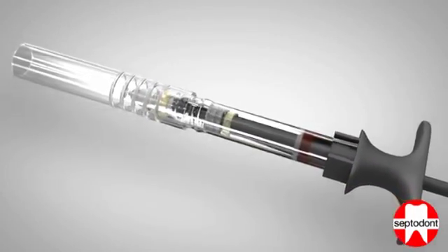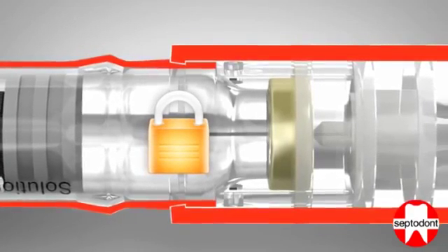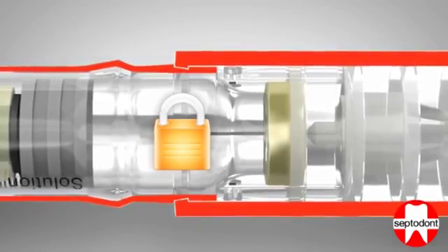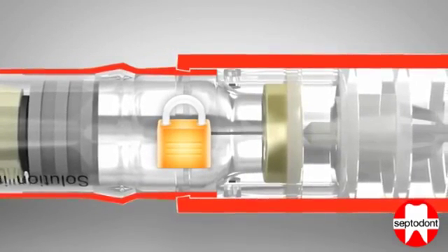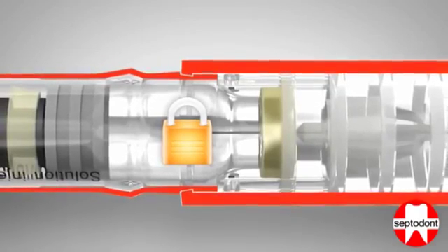Warning: when the device has been locked, do not try to force the protective sheath off the locked position. Instead, the syringe should be disposed of safely and a fresh syringe assembled to complete the procedure.